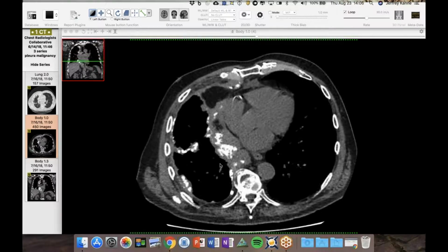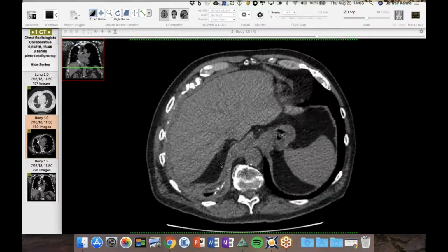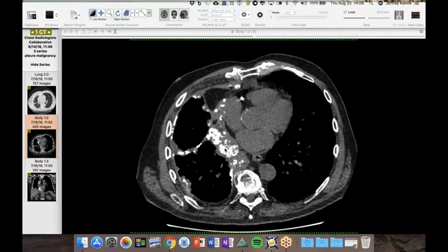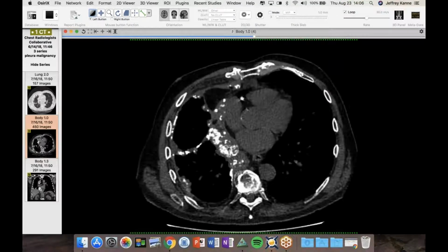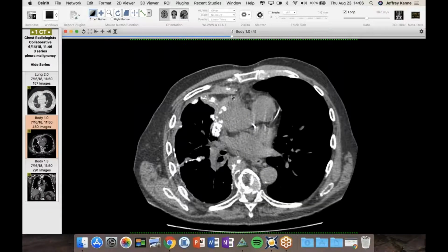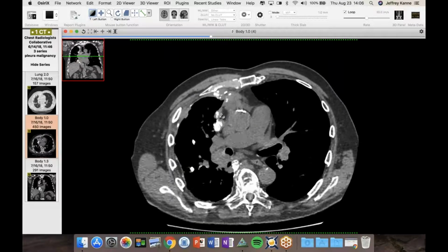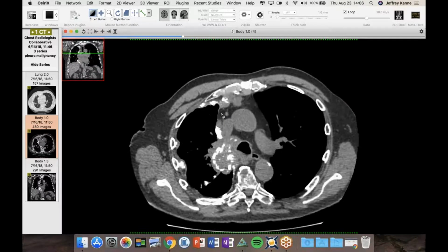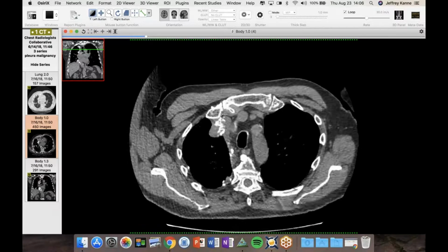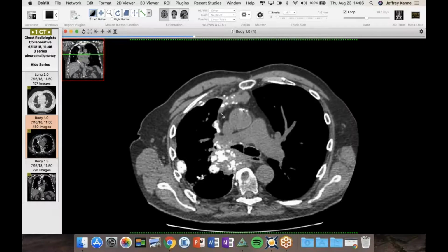To me, there was only one thing I could come up with. He has no history of malignancy that I know of. This would be a sarcomatoid mesothelioma, presumably with some osteoid or chondroid differentiation. And there's extension into the mediastinum, into the extrapleural fat right in here. So it's clearly a malignancy. Unfortunately, he was going to get his biopsy done somewhere else. But would you guys agree that this is a sarcomatoid meso without really any differential?